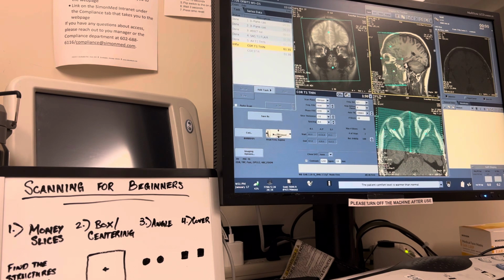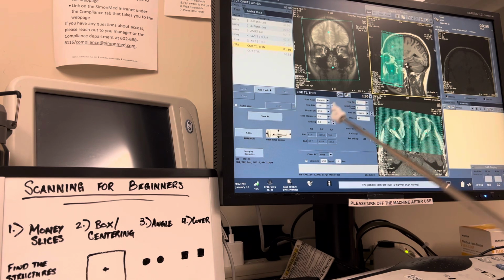So I would actually go the other way. I would, yeah, a little bit more than that, like right there. Because if you scroll up, you'll see why. Scroll up an image. There you go. You see that? You see how it curves up, whereas if you go down, it kind of flattens out. Go down one. You see how it flattens out? It basically goes like that. So, I'm trying to find an average there.